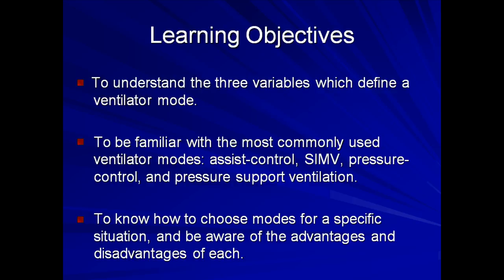People will often use different terms to refer to the exact same form of ventilation, and sometimes even use the same term to refer to different forms of ventilation. This is partially a consequence of different brands of ventilators coining fancy-sounding names for a basic vent mode, which could be known by a different name when delivered by a different brand of vent.